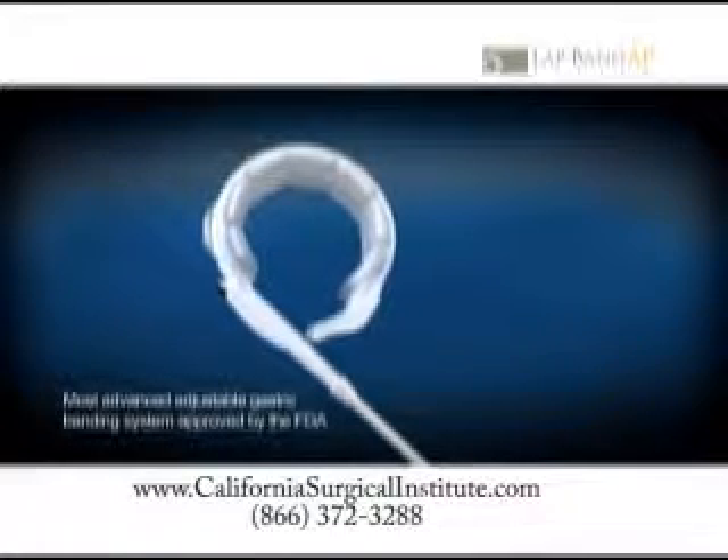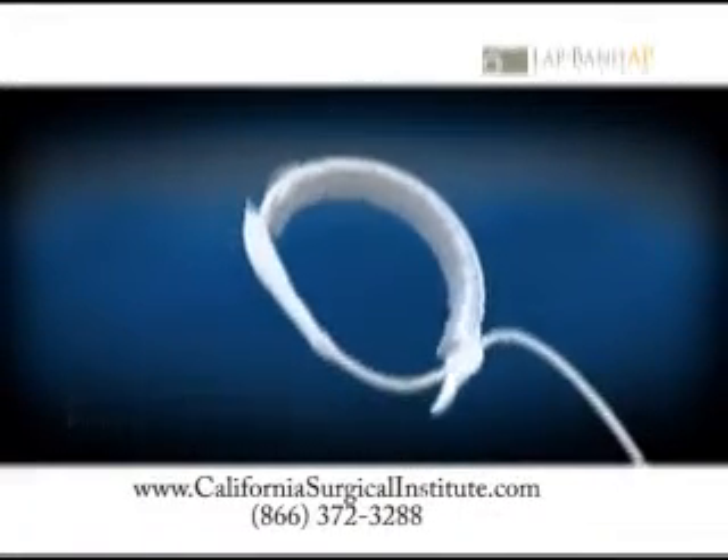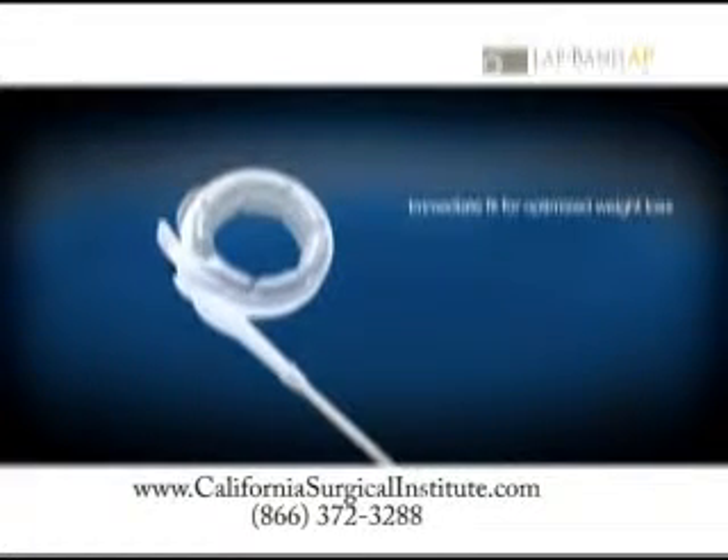When placed around your stomach, the LapBand AP system immediately provides a fit tailored to your anatomy, which allows for optimized weight loss right from the start.